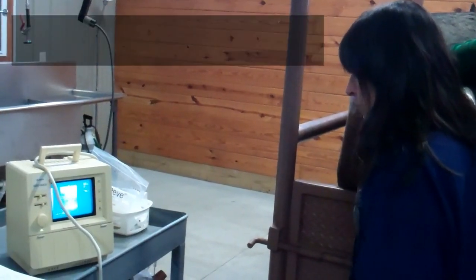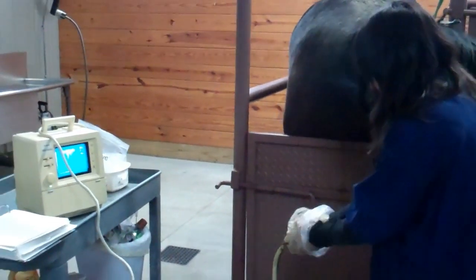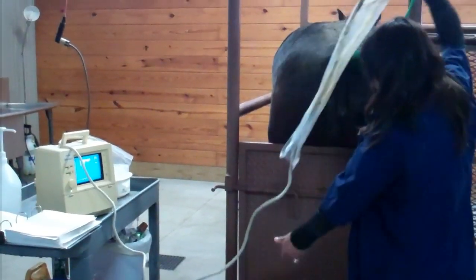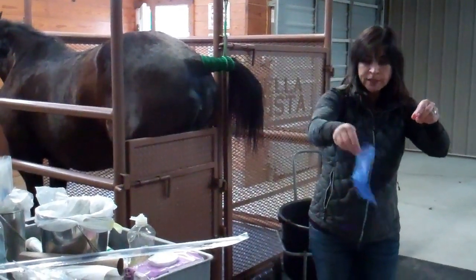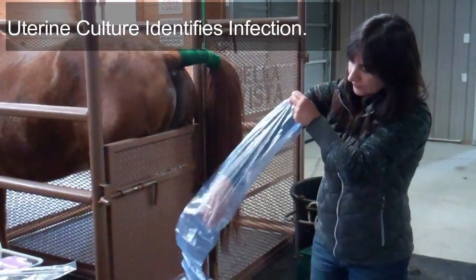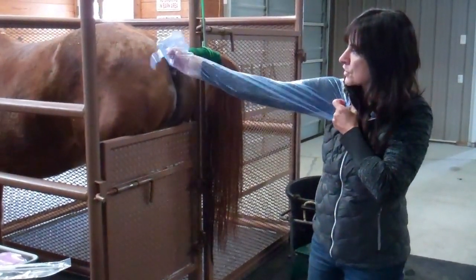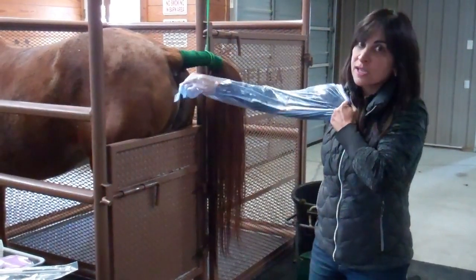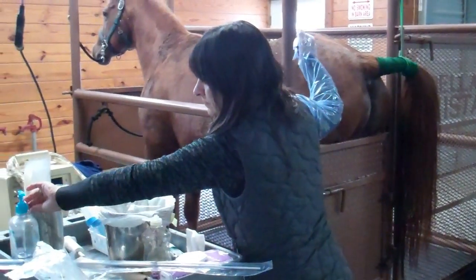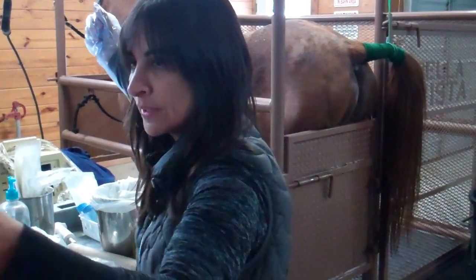So now that I've ultrasounded the mare and confirmed that she does not have any fluid, I'll go ahead and clean her up and do a culture biopsy. We're getting ready to do the culture now. We're going to make sure that after she was clean this year, she did not decide to get another infection.